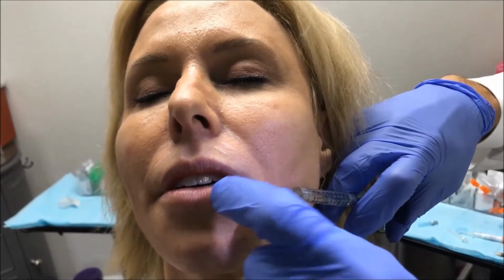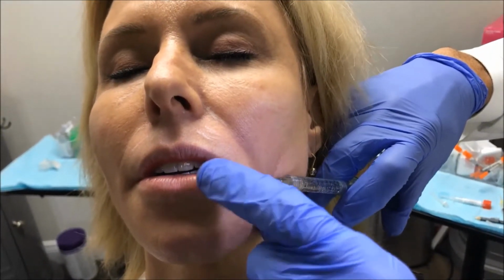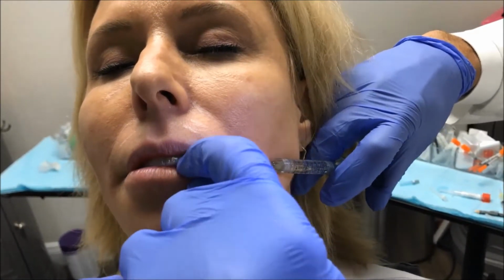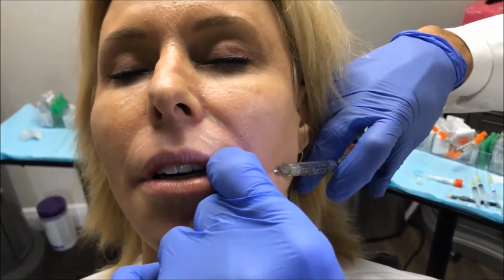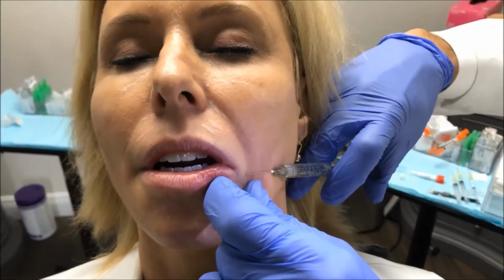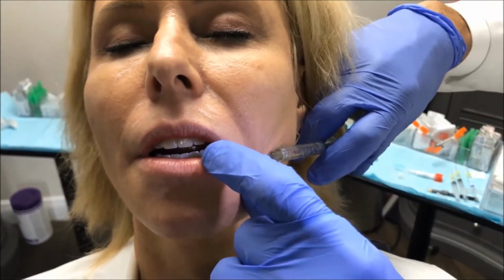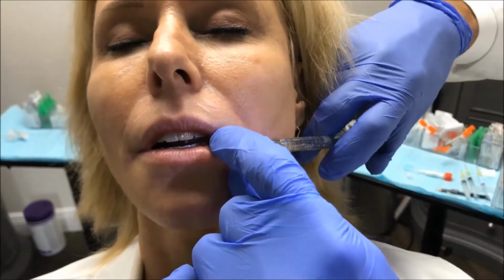I haven't really injected anything yet. I just want to get into the correct anatomic plane. Okay, now I'm there. My goal here is to be very superficial. This is a technique called submucosal shading, where we just put tiny bits of filler. Still not there yet. There we go. You really should be able to see and feel the tip of the micro cannula.